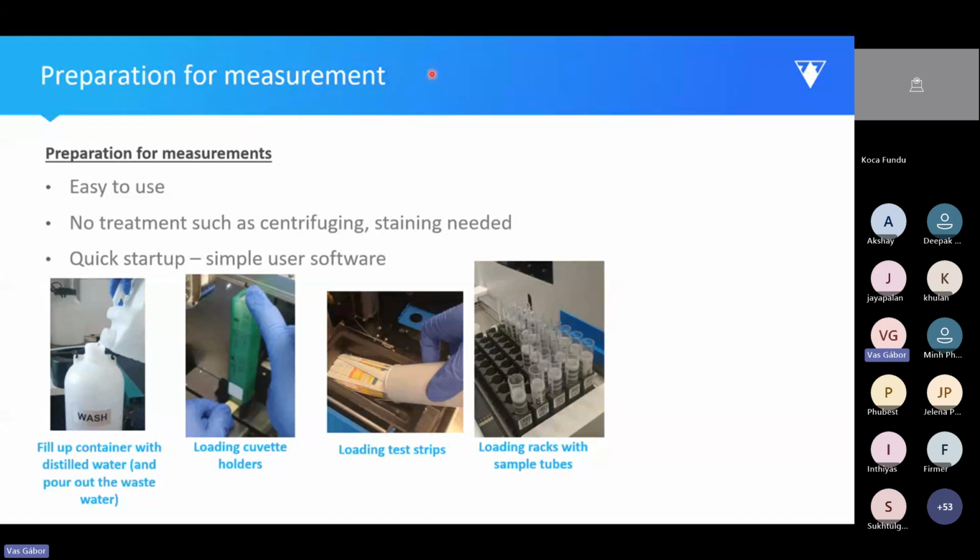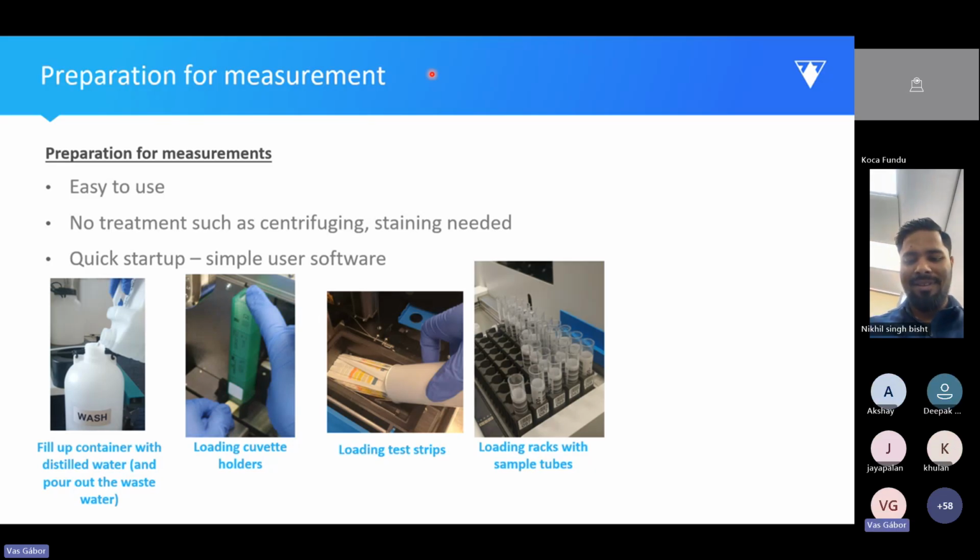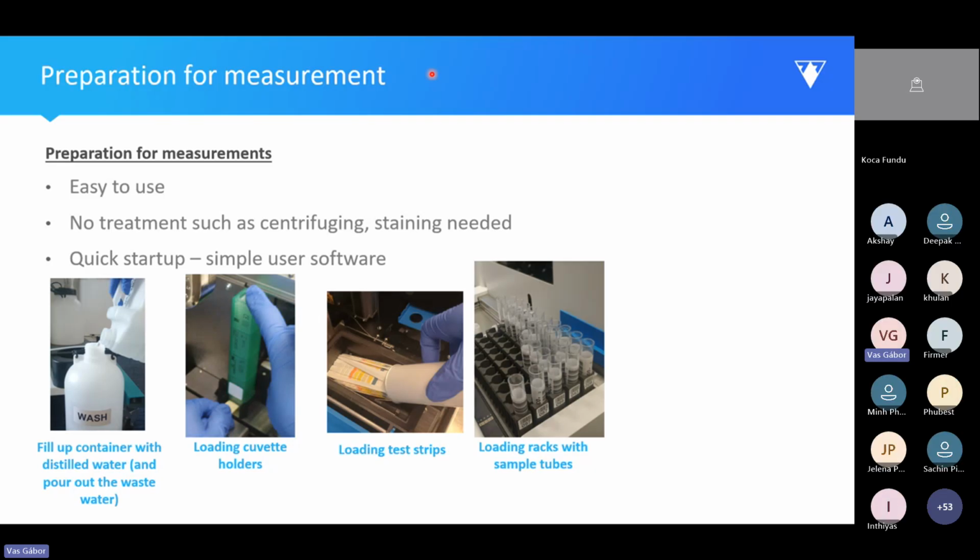Those who have experience with LABUMAT 2 and URISED 3 Pro, this has only one wet system, so one wash can and one waste can, but of course you can put two if you'd like to. Normally we ship it with one set of these cans, which also require less space and are easier to handle.